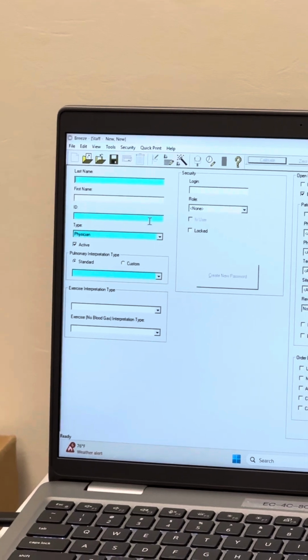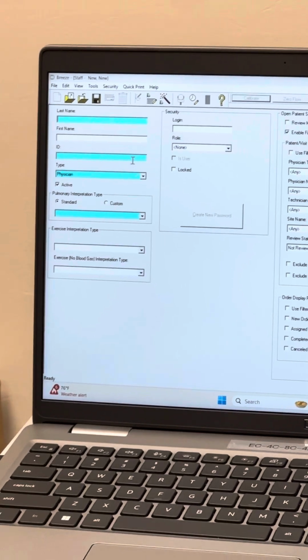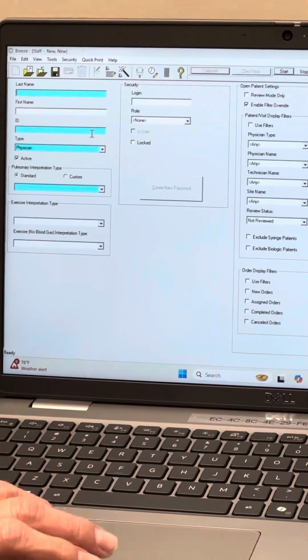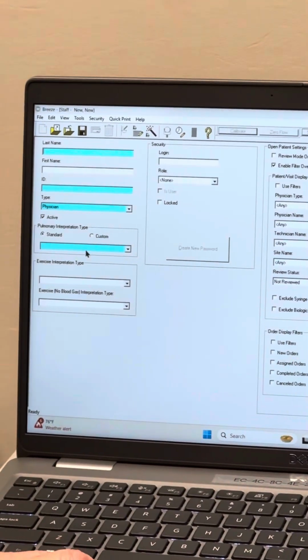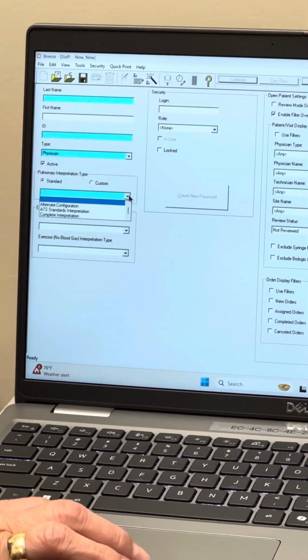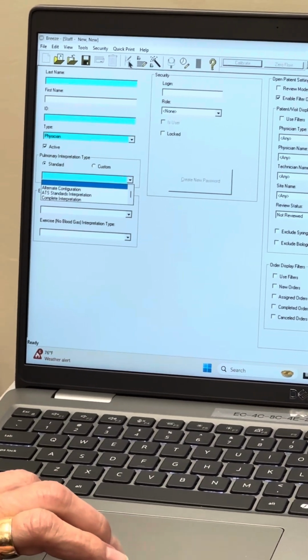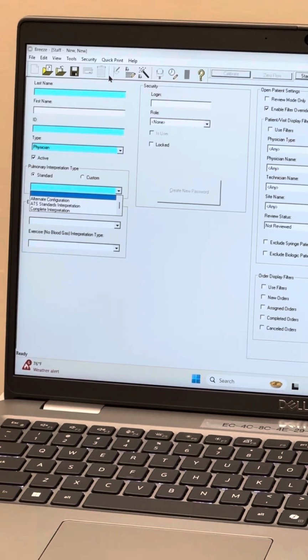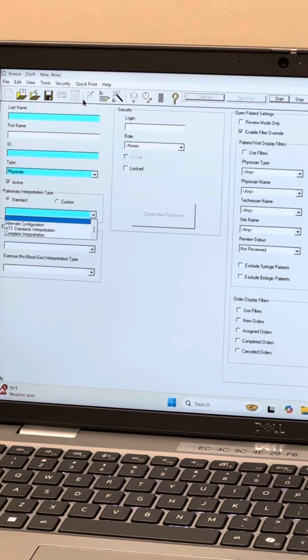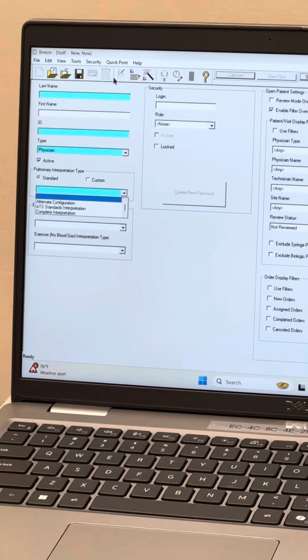As far as ID, if you have their employee number, you can do that. Otherwise, I would use their last name, first initial. The ID field is actually alpha or numeric. Okay. All of our patients, we use their MRN. As far as this field where it says interpretation type, I would choose ATS standard interpretation, the middle option. And you did order pulmonary consult. Do you currently use that, or is that going to be new for you? That's new. The pulmonary, right, Heather? Yes.